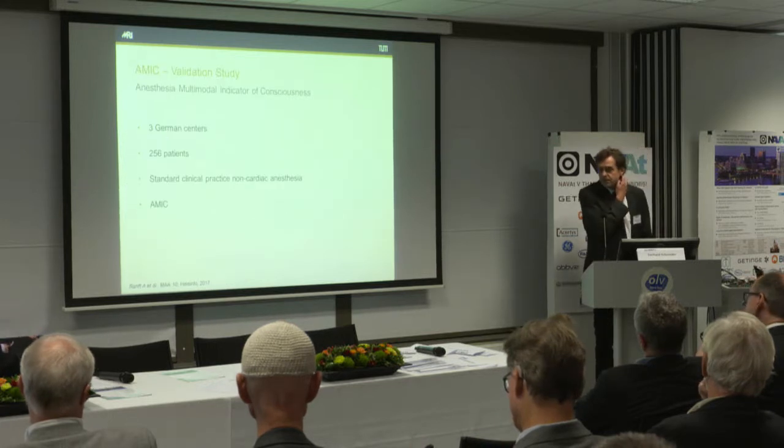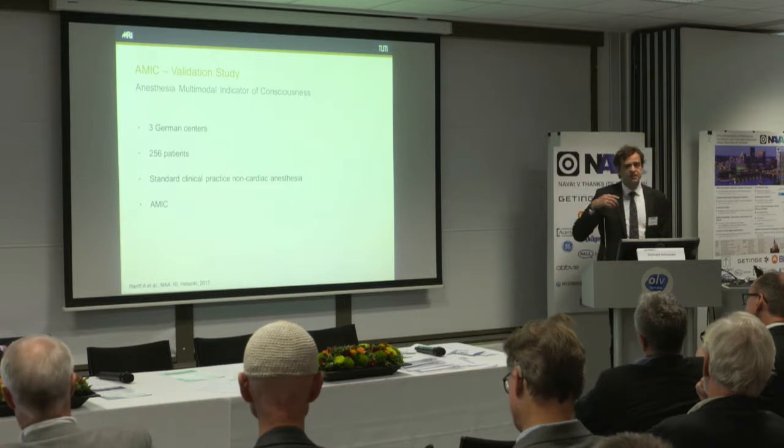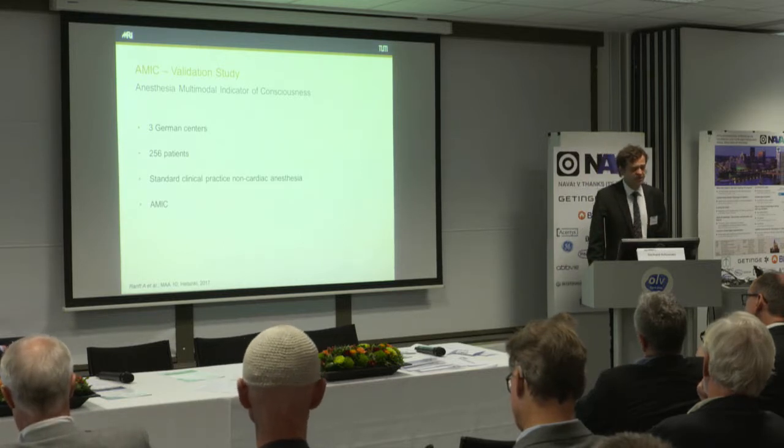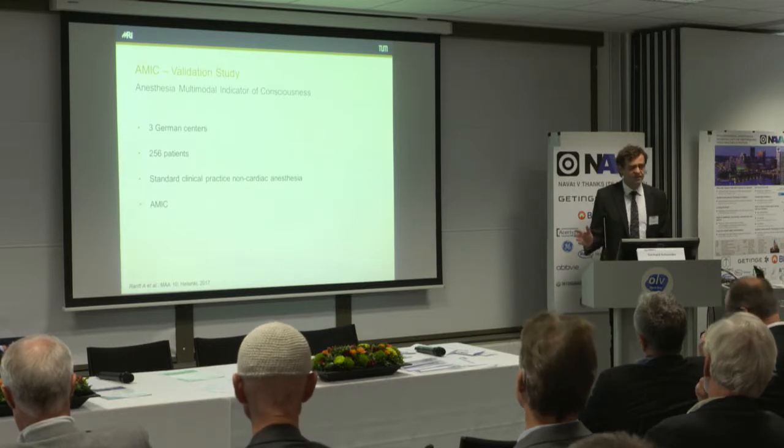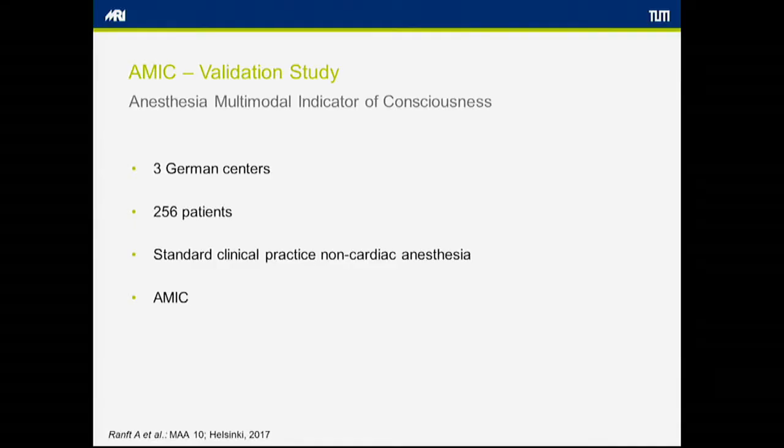Now, very recently, we completed a validation study of this monitor, still a probabilistic approach. The validation of the algorithm that has been developed was done in 3 German centers. Now, standard clinical practice, non-cardiac anesthesia, and the anesthesia multimodal indicator of consciousness, the AMIC, was used for that.